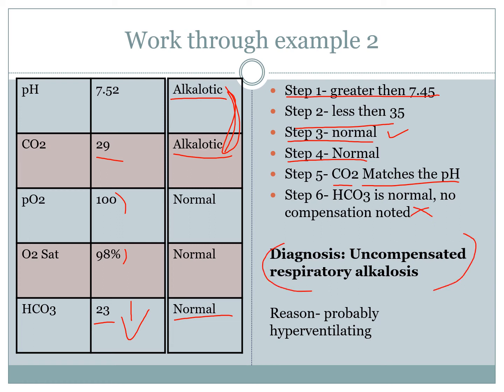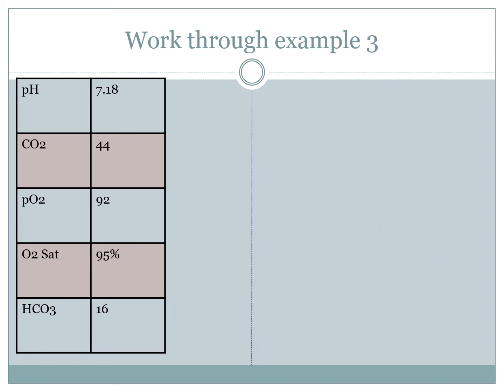Now, this sort of pathology, or pathophysiology, is generally what you see when someone is hyperventilating. Not excessively, but still hyperventilating a little bit. Good news is they slow down their breathing, bring on more CO2, and the problem resolves itself. Okay, it's not a big emergency. Okay, so that one there, quite simple to look at. Changing the scale up a bit. So same thing again, pause the video, test yourself.